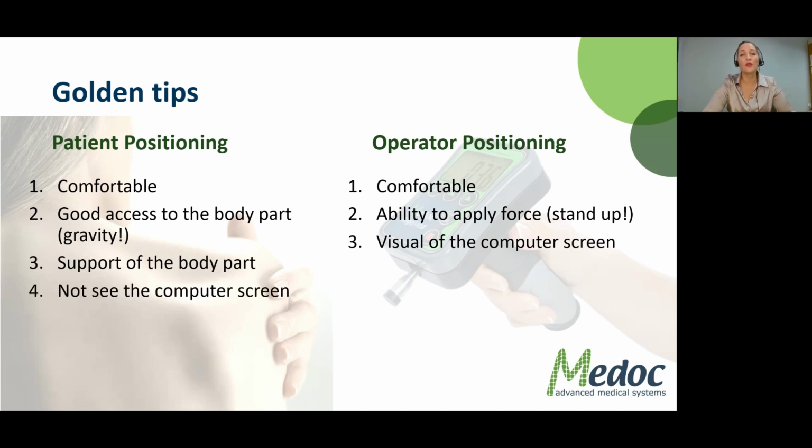But I don't want the patient to see the computer screen, because if the patient sees the computer screen, they can be distracted. They will QA you. They will say, "Oh, this was messy. You didn't do this quite well," or they will, as all patients will, try to be as consistent as possible. I want the patient to be concentrated only on the stimulus that you're applying, and not about anything else. They don't need to see the computer screen.